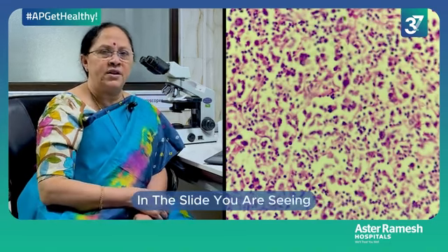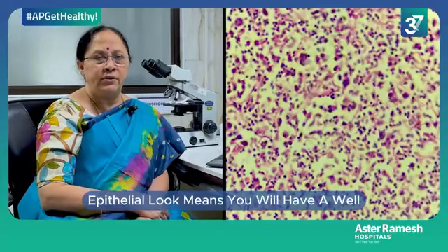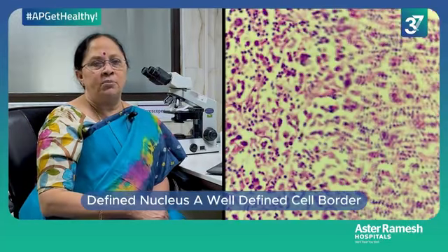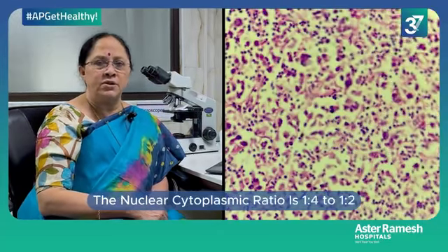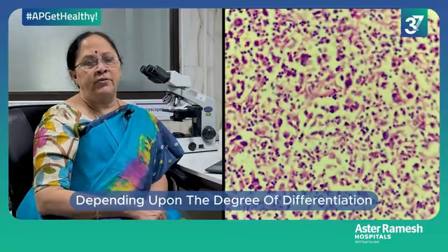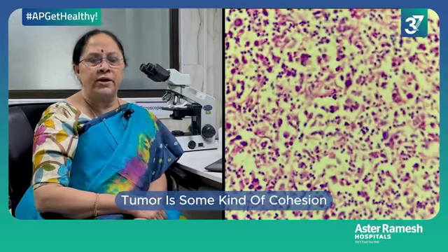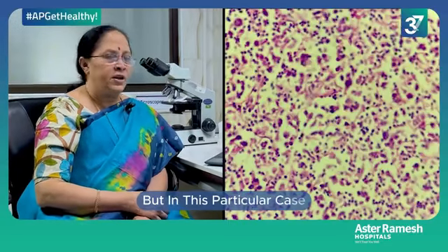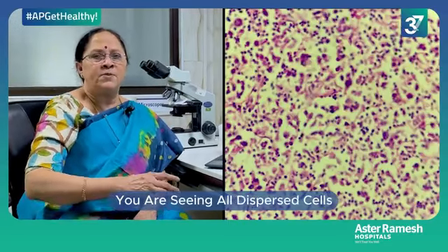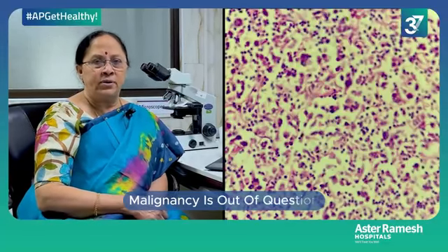In the slide you are not seeing any epithelial look. Epithelial look means you will have a well-defined nucleus, a well-defined cell border. The nuclear cytoplasmic ratio is 1:4 to 1:2 depending upon the degree of differentiation, and the feature of epithelial tumor is some kind of cohesion. But in this particular case, you are seeing all dispersed cells. So, secondary deposit from epithelial malignancy is out of question.